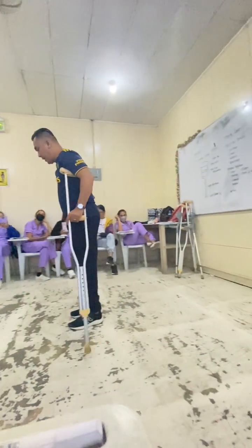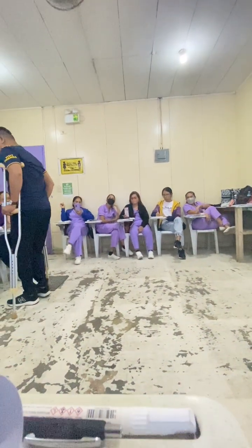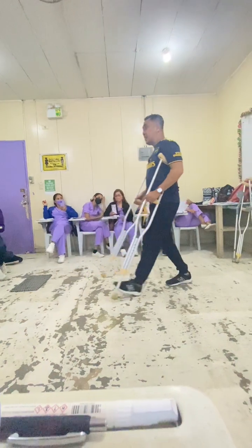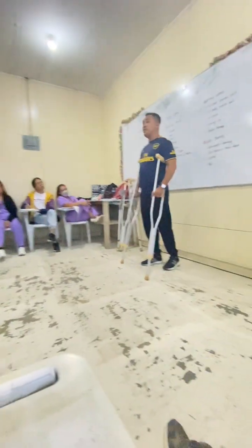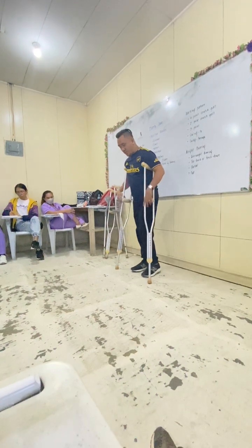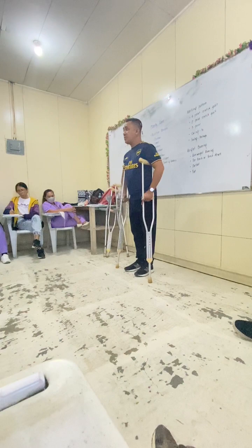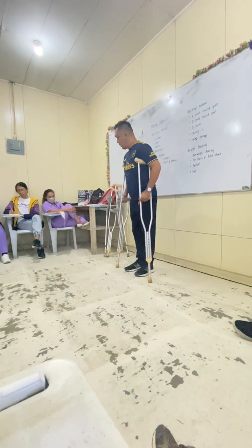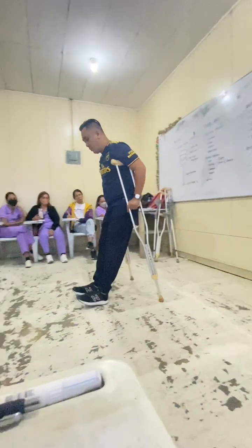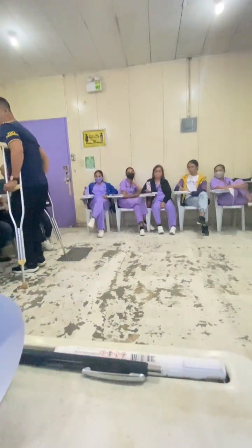If both legs are injured na siya, swing to. Yes. Because they have a kutob sa crutch tips. But if the patient is already familiar with walking using the axillary crutch and both feet are kanang injured na siya, then pwede na siya mo swing through. Okay? Lapas na si swing through.